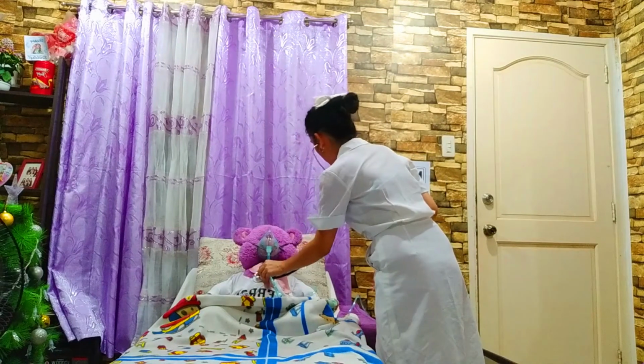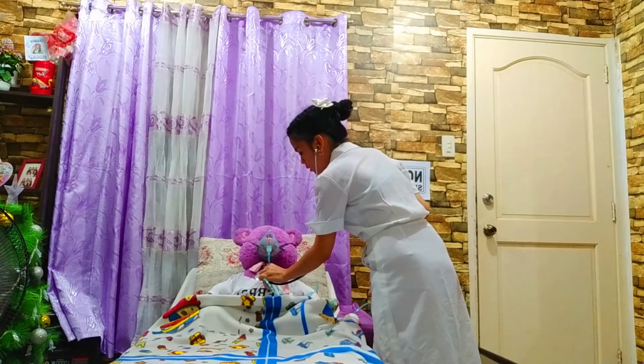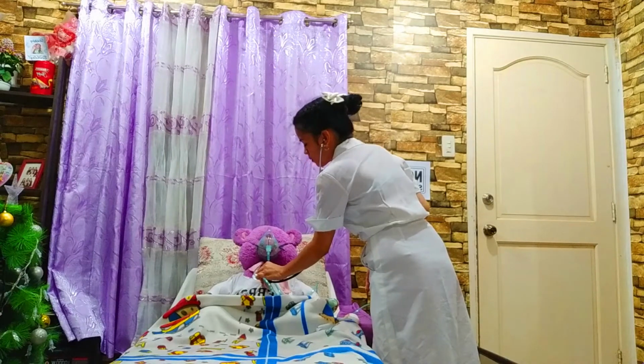Can you inhale and exhale po, ma'am? Okay.